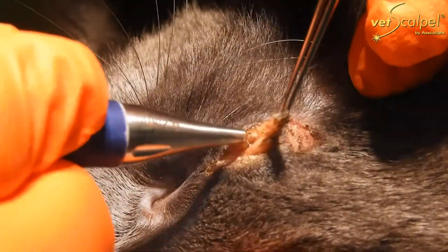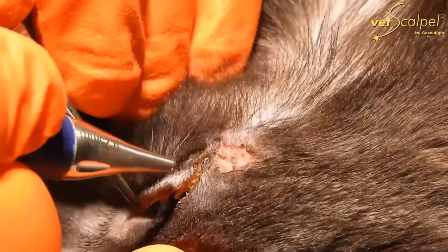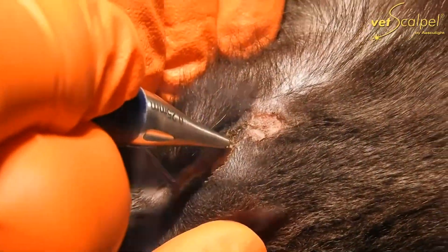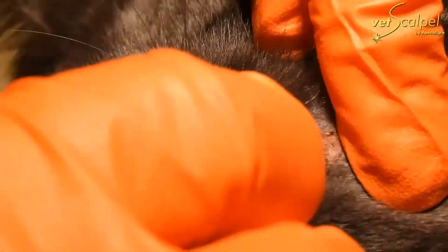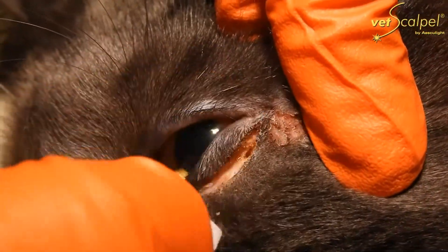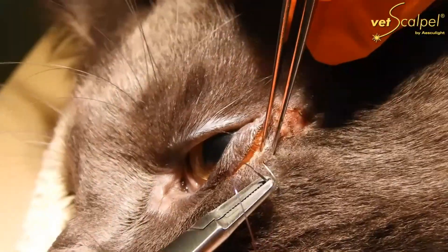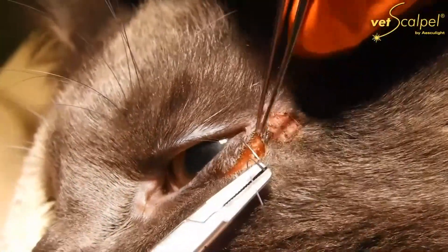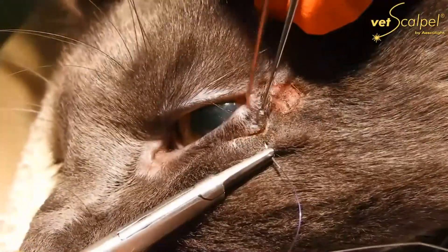We're removing the redundant piece of tissue from the eye. There's no easy way to measure these, so you pretty much have to look at it and decide from your initial incision whether you have enough tissue removed to clean this up. The char is removed with a little gauze pad that has saline on it, and then we're using 4-0 suture material to close with and a taper needle.